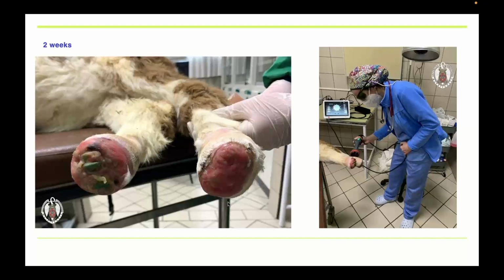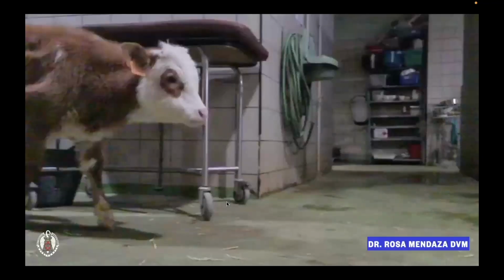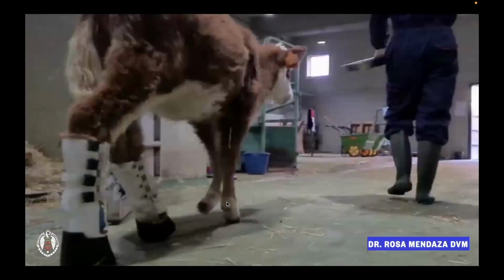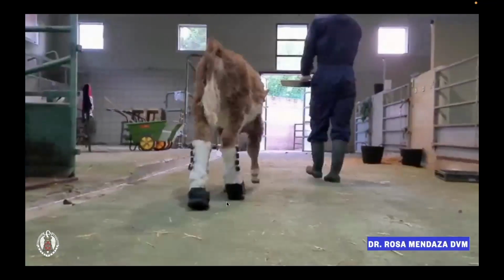Not bad at all. We were treating 3 times per week, and the evolution in the next weeks was excellent. Notice how the granulation is complete, and there is already some epithelialization, and also the hair starts to grow back on most of the wound. My colleague Rosa Mendaza designed and produced prosthetics for her, and this is a video with the prosthetics, which were later modified. The animal was donated by the owner and went to live in an animal sanctuary.